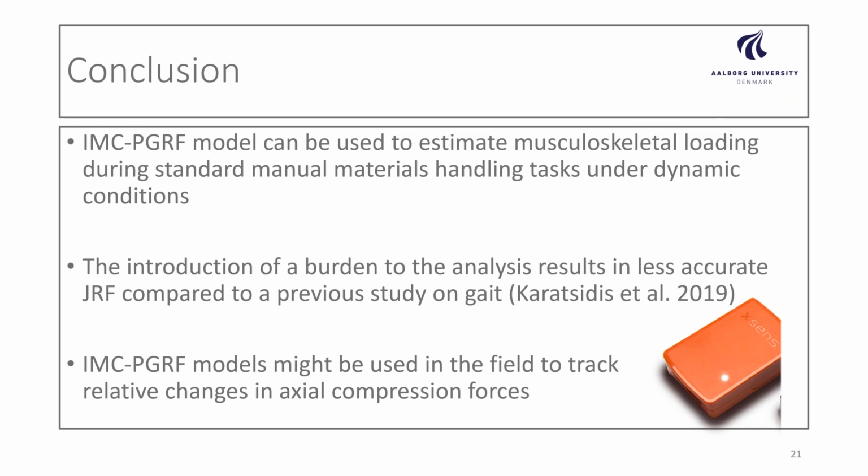So overall, the inertial motion capture model with predicted ground reaction forces has here been shown to be possible to estimate the musculoskeletal loading during manual material handling tasks under dynamic conditions.